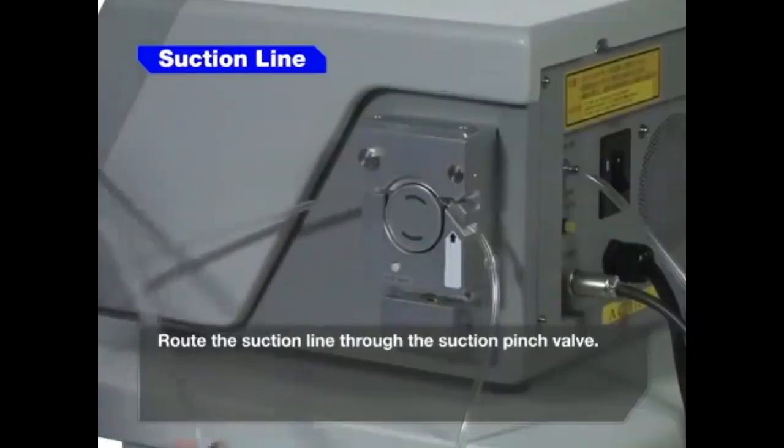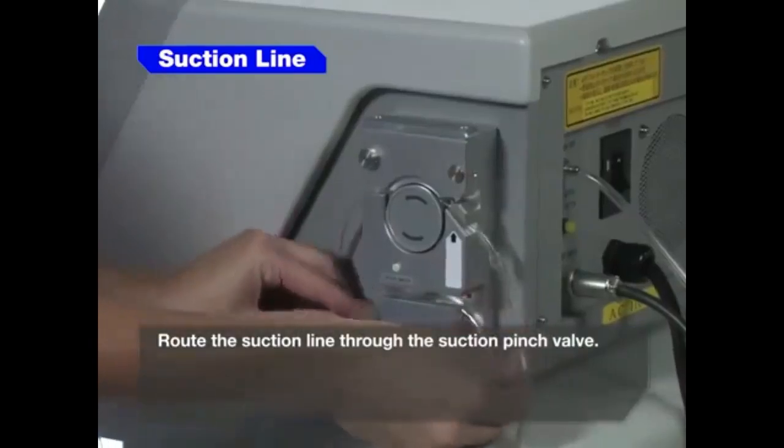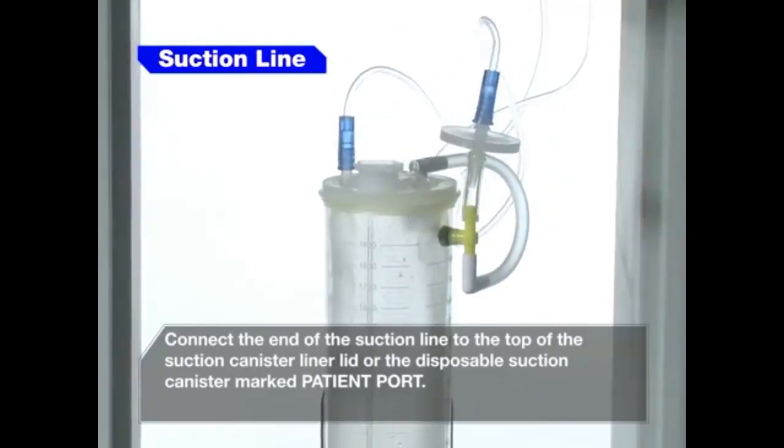Route the suction line through the suction pinch valve. Connect the end of the suction line to the top of the suction canister liner lid or the disposable suction canister marked patient port.